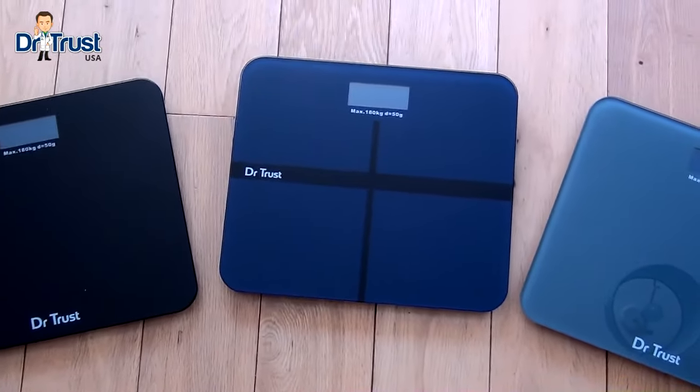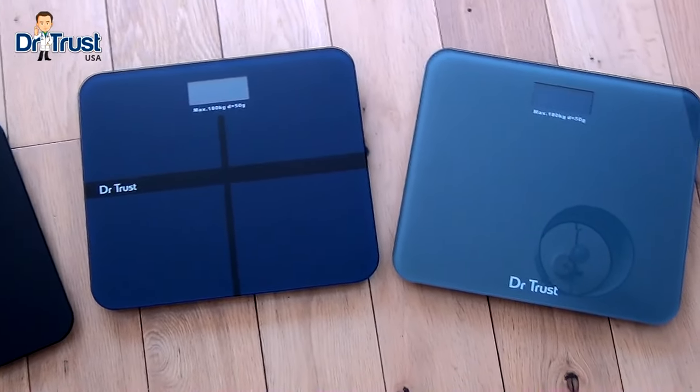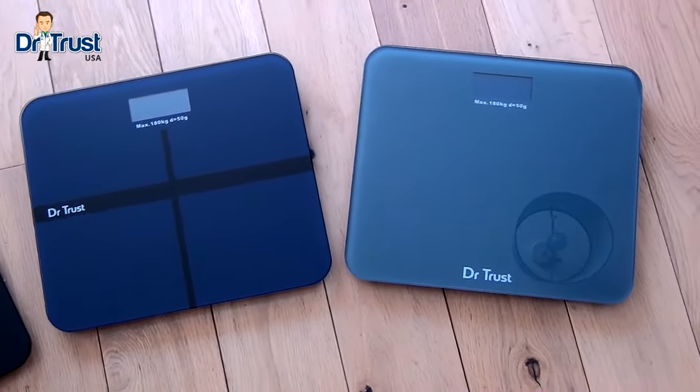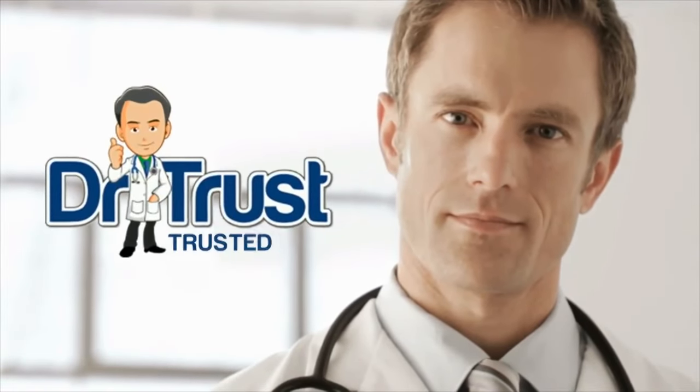Keep track of your weight your own way with the Dr. Trust Platinum, Executive, and Zen rechargeable personal scales. Dr. Trust — trusted for life.